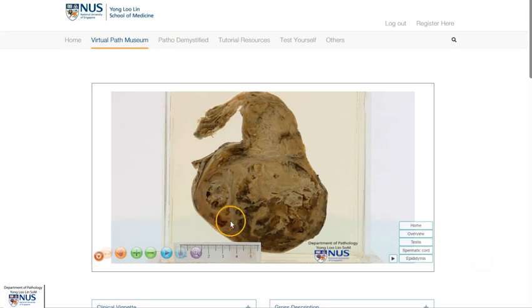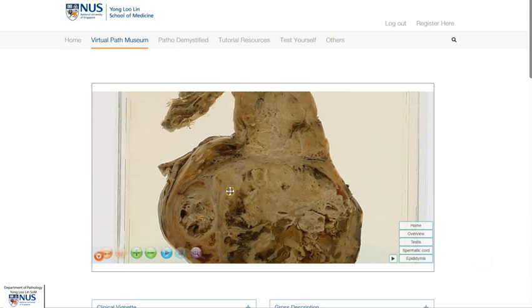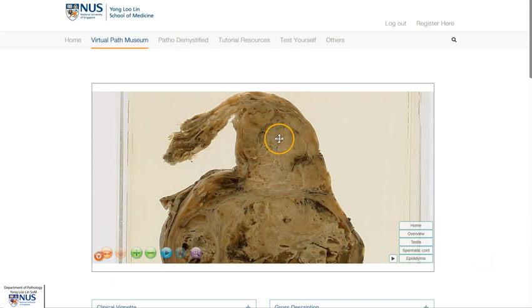Within the testicular parenchyma, there is a large, fleshy, pale tan tumor, and we can see the tumor in this region. It is replacing pretty much the entire area of the testicular parenchyma in this cut section, and the tumor is also involving part of the spermatic cord.